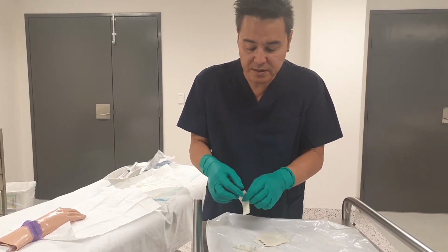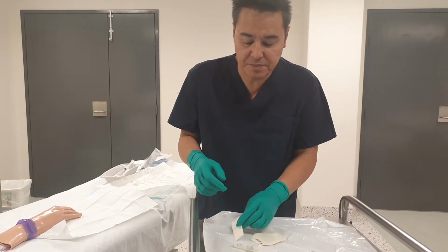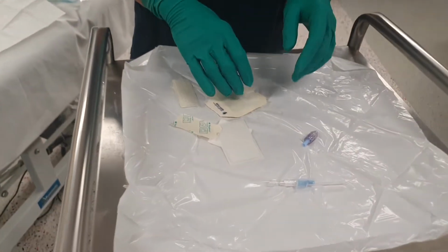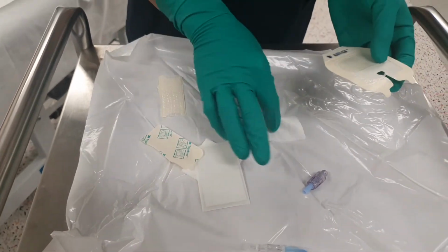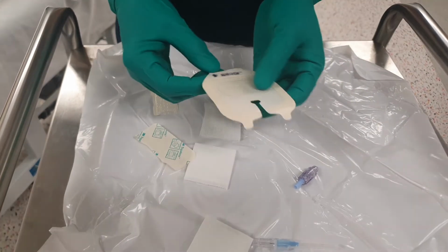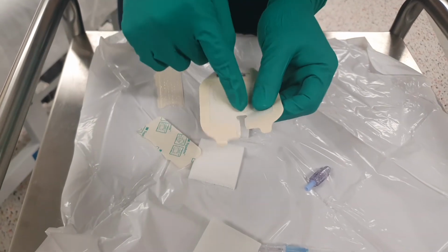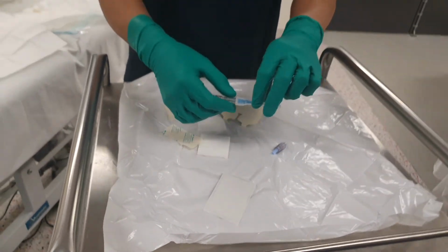And I can access my Steri Strip. So this is just one Steri Strip, and you can get two. I'm a little bit of a fan of the two Steri Strips, but that's okay. They give you a gauze square to mop up any excess blood, and you've got your occlusive dressing here. And see how there's a bifurcation there? I'll talk about that in a moment. Okay, so cannula.